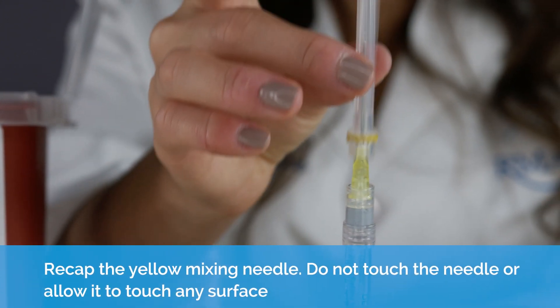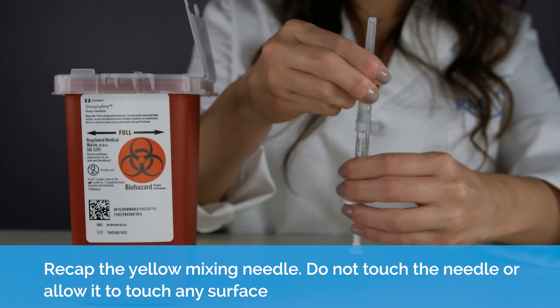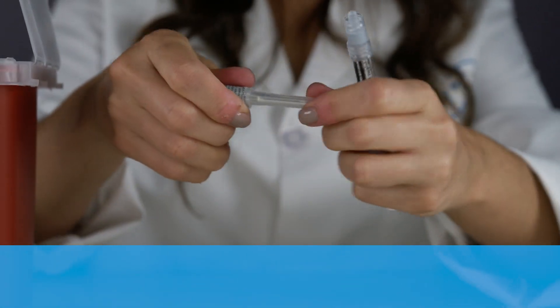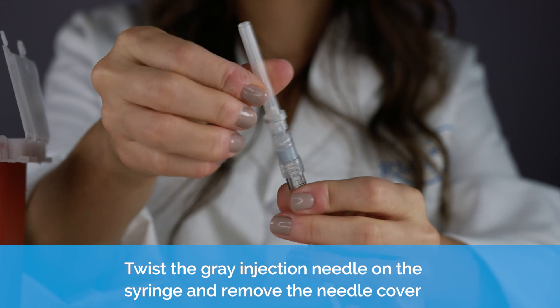Recap the yellow mixing needle. Do not touch the needle or allow it to touch any surface. Place the needle in the red sharps or biohazard container. Twist the gray injection needle onto the syringe and remove the needle cover.